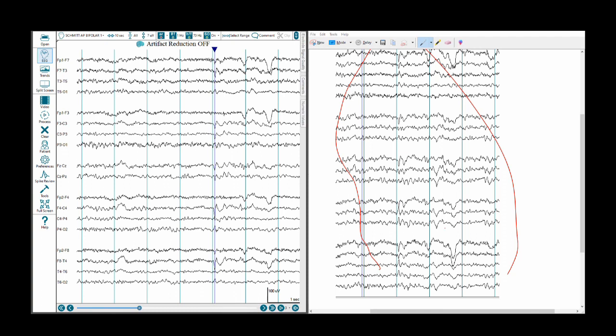If we look at the image here, there is certainly a field that extends to the parietal region. If we go to the midline set of electrodes, we can see that there is a downward deflection. That is not because CZ is the complicit electrode recording a negative discharge. It is because FZ is recording a positive dipole associated with this discharge. Since FZ is an input 1, there is a downward deflection. Similarly, as CZ is compared to PZ, CZ is relatively close to this dipole, so it is going to be more positive at that moment in time as compared to PZ.